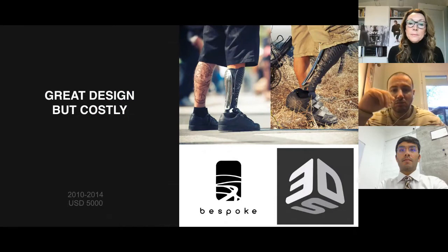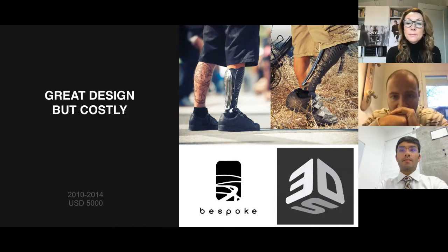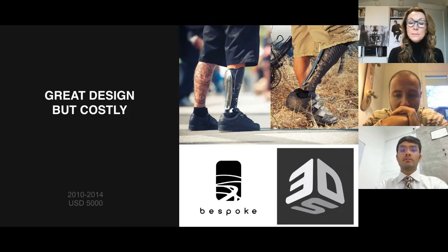But what was great to see in 2010 to 2014 was that there were a couple of companies popping up. 3D Systems, which is the leading company in 3D printing, did come out with very interesting, well-designed prosthetic fairings, they called it, that wrap around prosthetics. Actually it was Bespoke, a small startup company out of San Francisco that did this and sold to 3D Systems. And so this was very early days, and the prices were extremely high.